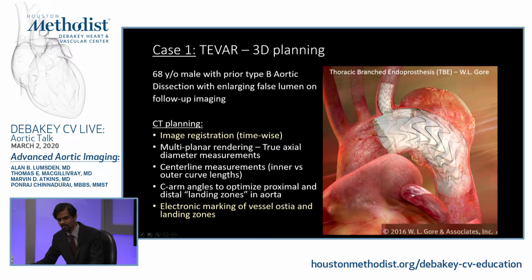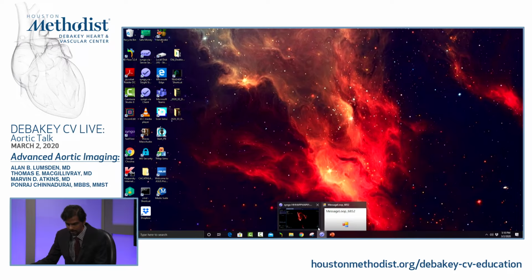So this is a device that we are planning to deploy in this patient, which has a branch to the left subclavian artery, so that way we have enough landing zone. So I'm going to quickly toggle to the CT data set.